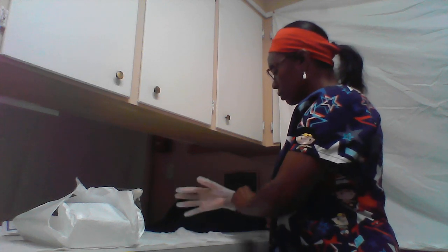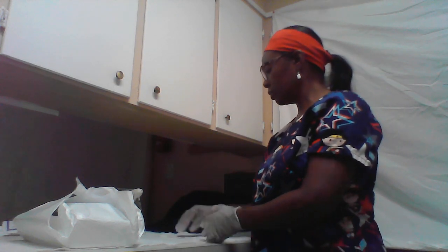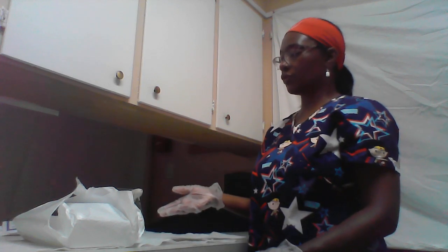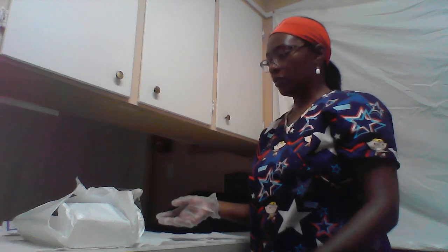the catheter. First of all, I'm going to wash my hands thoroughly, and then I'm going to apply clean gloves. I already have my supplies readily available. Patient is draped. Now I'm going to open the sterile field, making sure to maintain sterile field, starting on the far end away from me.